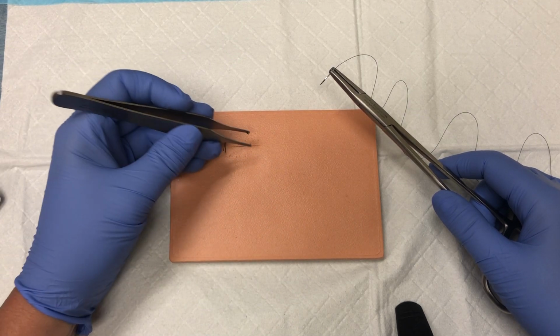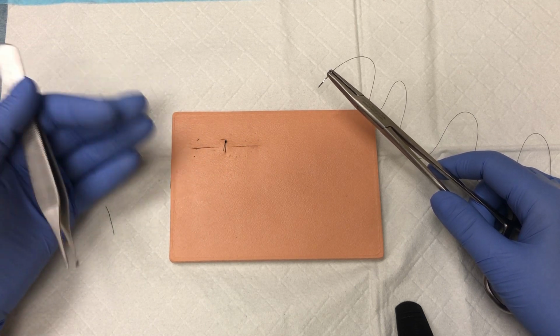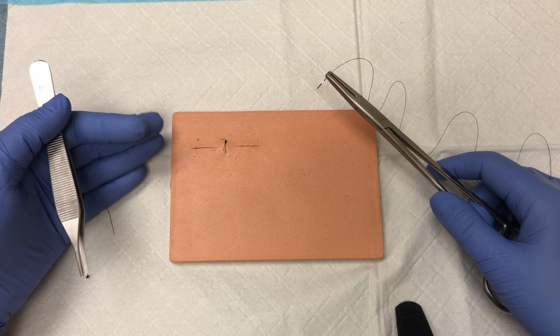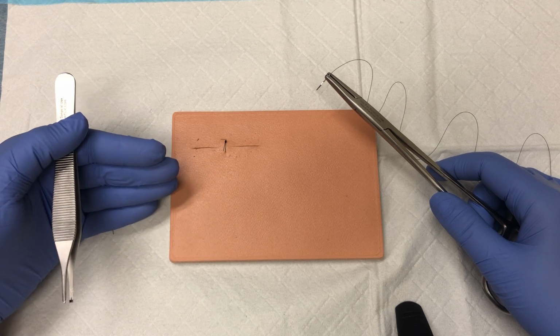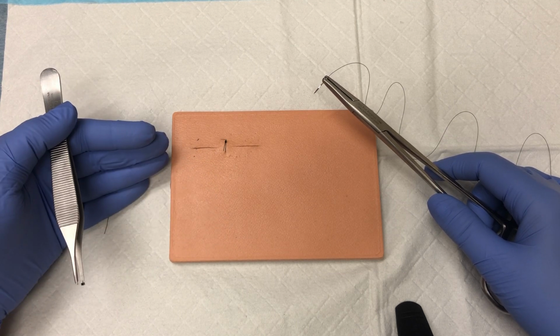Now, do you need to suture the actual end? No, you don't. Remember that the goal of simple interrupted sutures, be it on the skin or in the fascia, is just to start to improve that overall body healing process and allow for that primary closure.